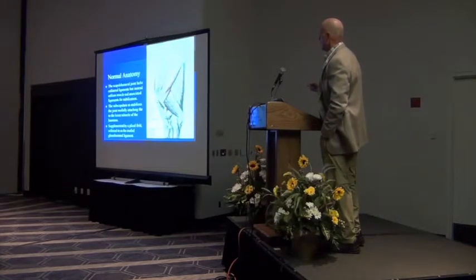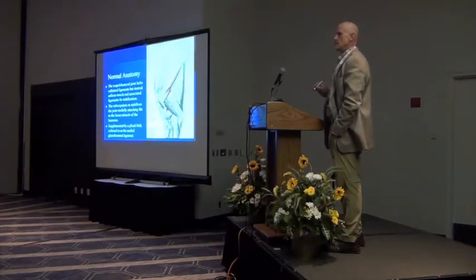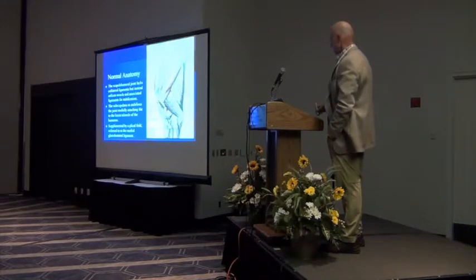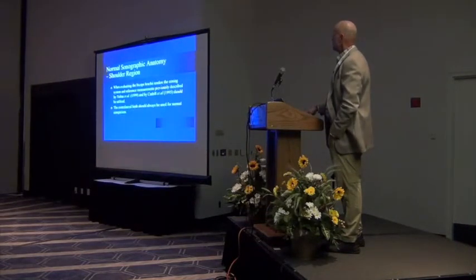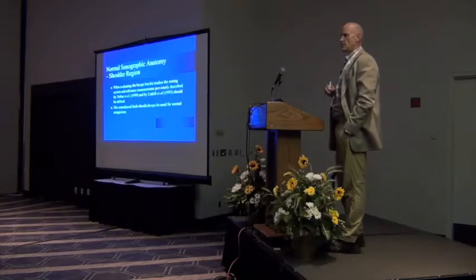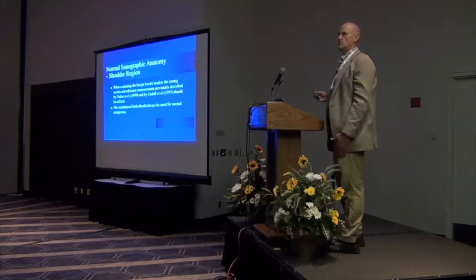And I only put this in here because there is one little plica that sits in the medial aspects of the joint that may add to stability of the joint, and it's only seen from my perspective with the arthroscopy. Now, there are papers out there talking about zones. I've gotten away from looking at it from the zone standpoint because I know where I'm at just based on the shape of the structure.